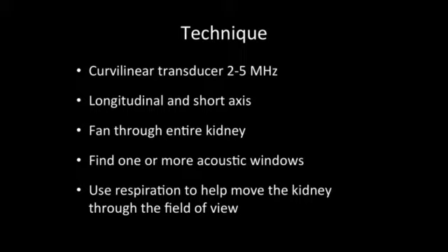And when you've got a good view, you then fan right from one side of that organ to the other side. So if you're in longitudinal view of the kidney, once you've got that good view through your acoustic window, you fan all the way to the left and then all the way to the right. When you're looking at it in short axis, transversely, you fan all the way up to the top and all the way down to the bottom.